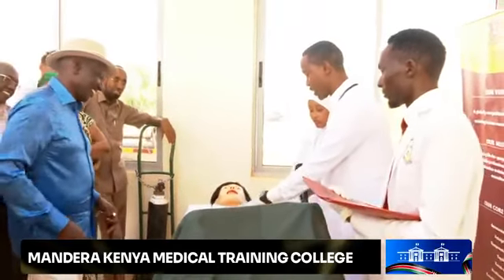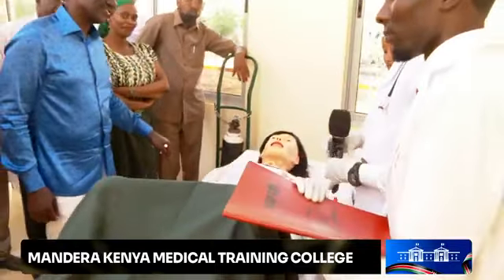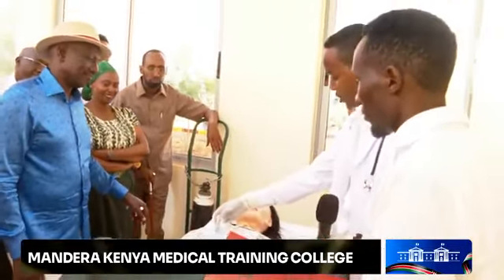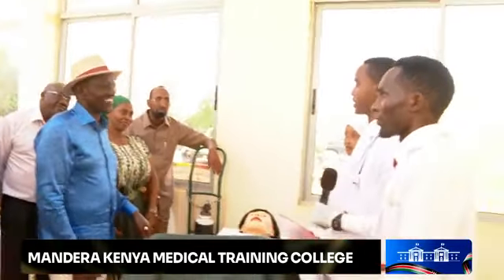So this one is a urine bag. We will accumulate the amount of fluid that comes from the bladder, and we have the measurement ranges here. It will help us know how much fluid we got from this patient. And that is how the procedure is, Your Excellency.